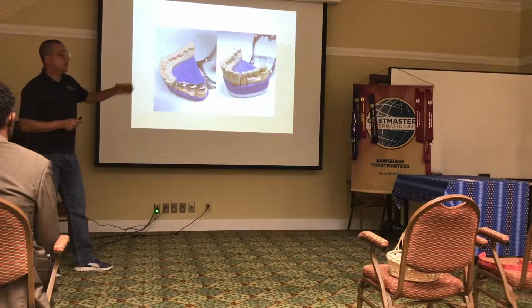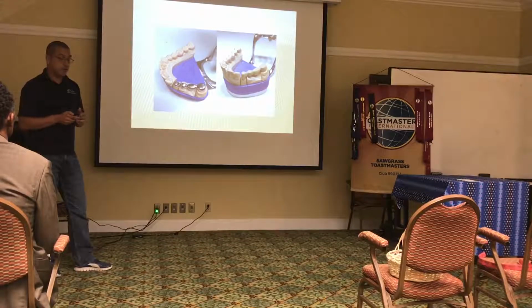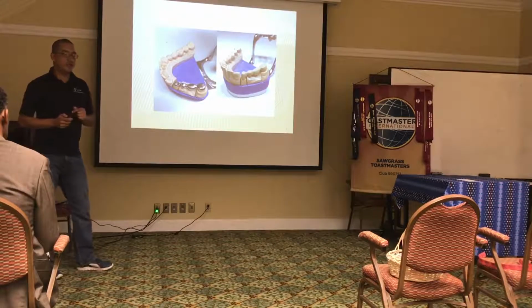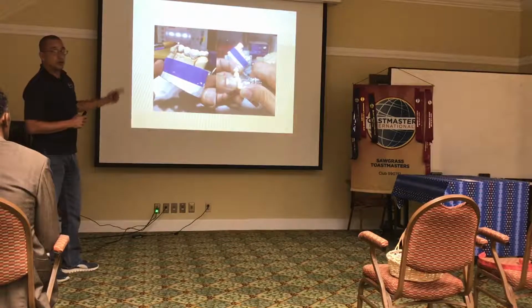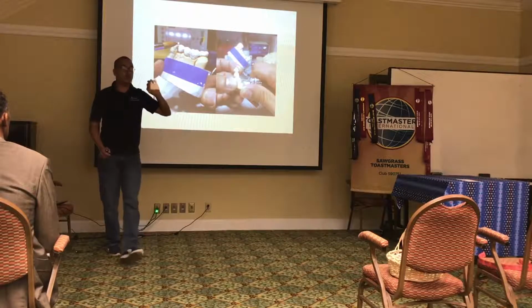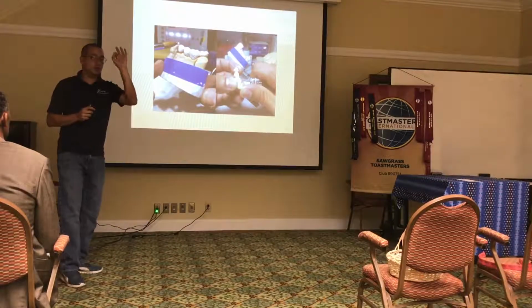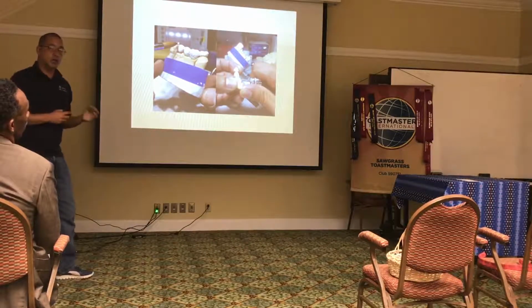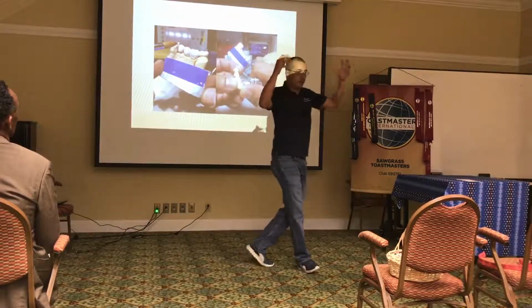We opaque, we mask the metal so it doesn't show, so it can look kind of natural. I see a lot of faces like, oh, that looks weird. But that's how we make teeth. And then we go ahead and start porcelain. If you realize, little drops with a brush. It's like doing a sand castle. We put little balls of porcelain, and that makes porcelain as a powder with water. We mix it so it goes little by little, and we start building it.